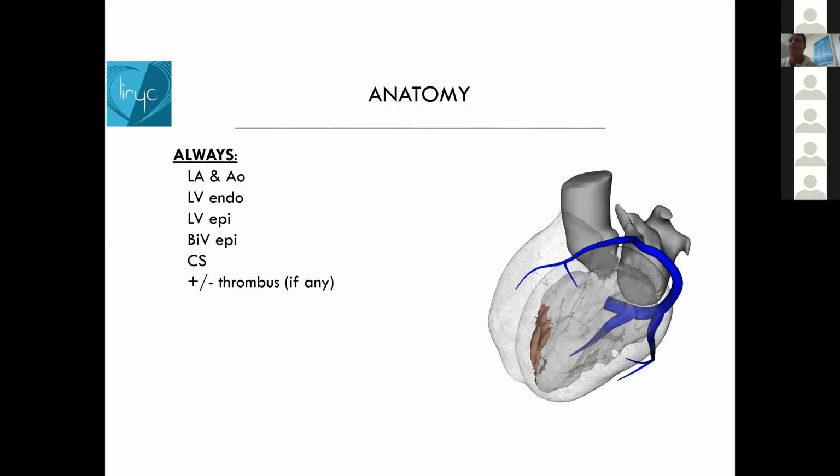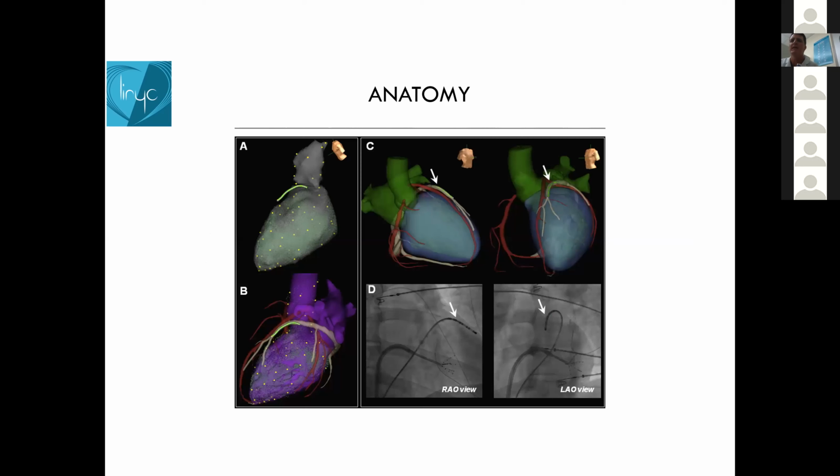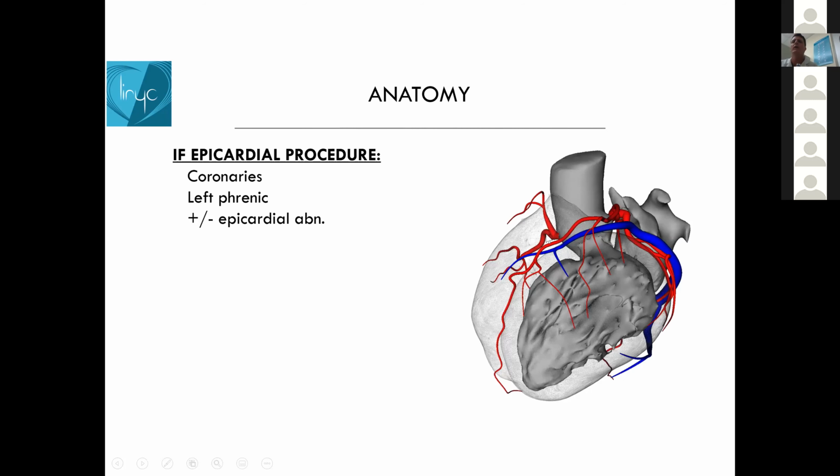And so this is the model that is built, and you get this anatomy that you can then integrate with the mapping system. It's helpful to place catheters in venous structures. That's often our workflow, is to use coronary veins, and we can create a pretty dense map. If we get more branches, all the better, because it makes for easier registration. And that's relevant for avoiding coronary injury, particularly in epicardial procedures, and the phrenic nerve.